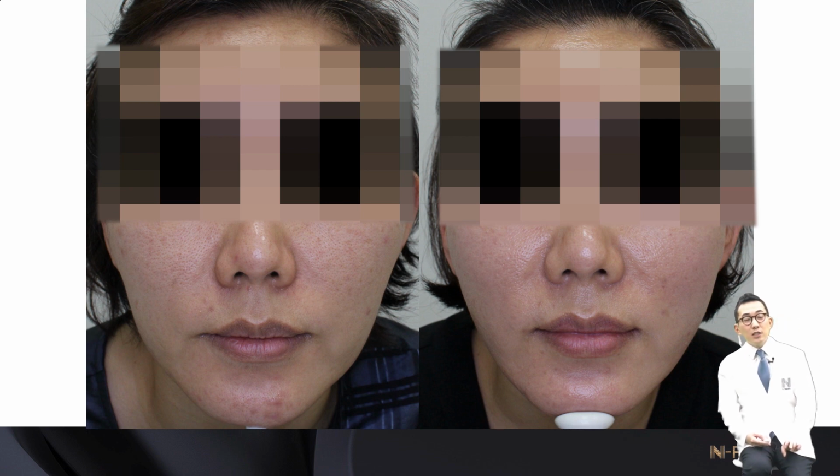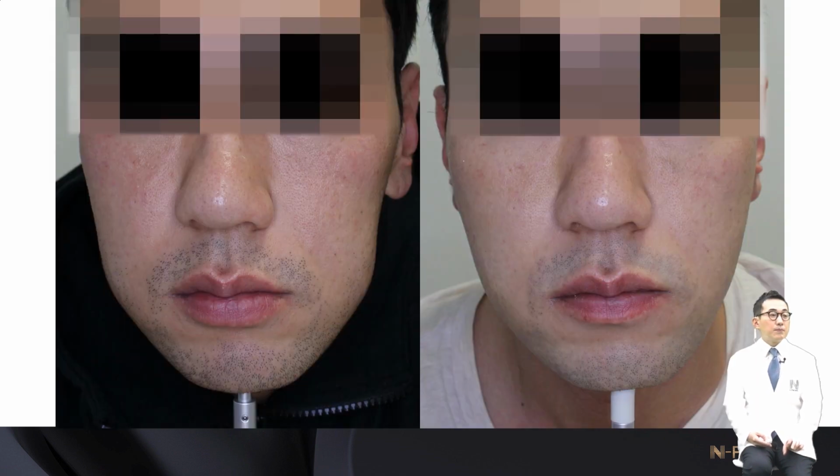But if the insertion point is high, so the skin gathering point is not the subzygoma but the zygoma that has already protruded, the worst result will come out, like the photo I showed earlier. Although the procedure is equally perfect, small differences in design can make a big difference in result. The same goes for this one. Since I lifted the saggy cheek and moved it to the subzygoma, the facial line got better, right?